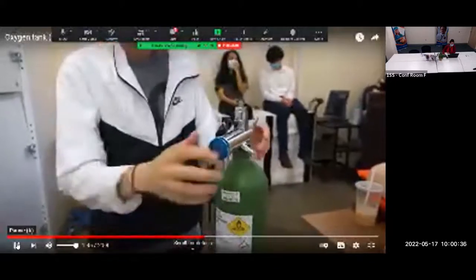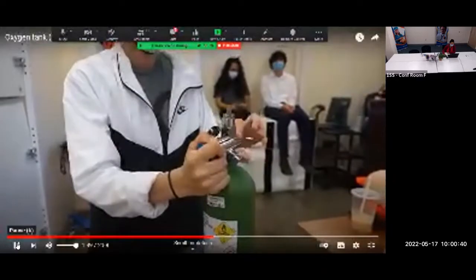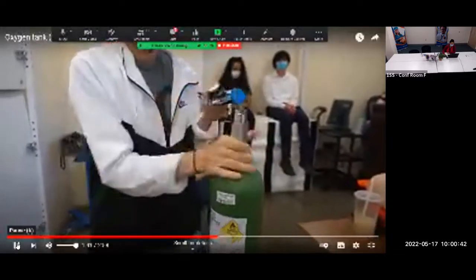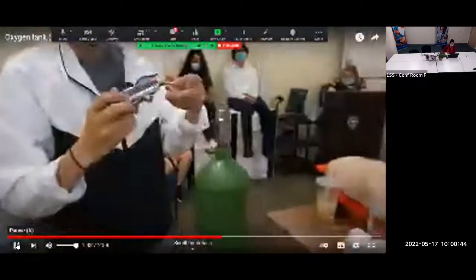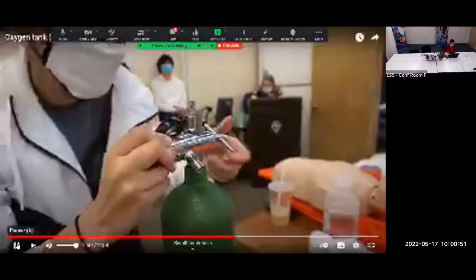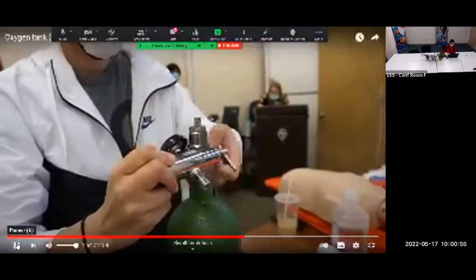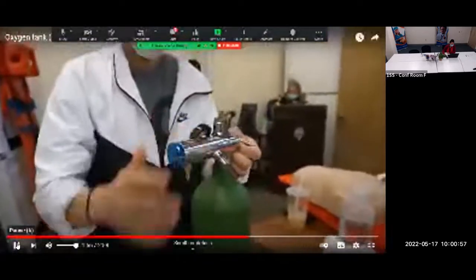And so you've reclosed the tank, and you're going to take the regulator off and try it again. So you have the two teeth. You're going to put the two teeth into the gums. Awesome. And then go ahead and crack the tank.